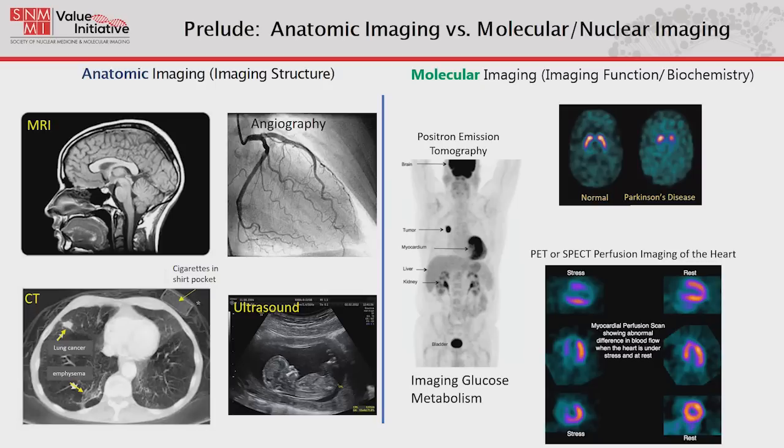What you see on the left of that slide is one of our FDG scans, fluorodeoxyglucose. And here what we're doing is we're imaging glucose metabolism. Because there's glucose metabolism all over the body, you can kind of see the anatomy, but that's secondary to the fact that we're imaging glucose metabolism. You can see the uptake in the brain because we're thinking. You can see the uptake in the heart because it's a muscle and it's pumping and they're using glucose for fuel. But you can also see the tumor in the lung, which would just be a nodule on a CT. Malignant, not malignant, don't know, but because of the high uptake, we can actually pretty confidently describe that as a malignant tumor.